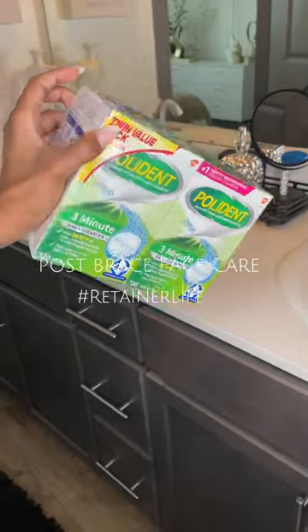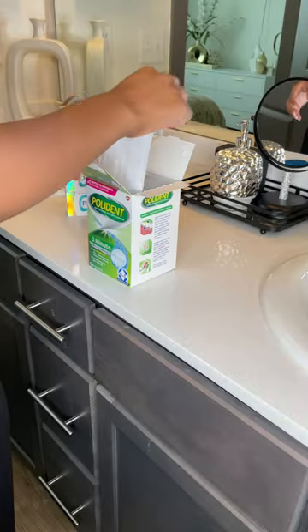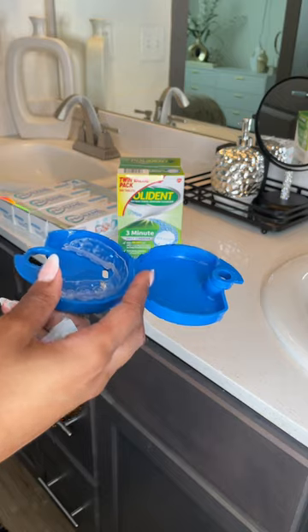And honestly, I really hope you're wearing your retainers after you took off your braces. This is how I take care of my retainers. I use Polident and I soak it in there every single day since 2018. I know that's crazy, right? My teeth are so straight.